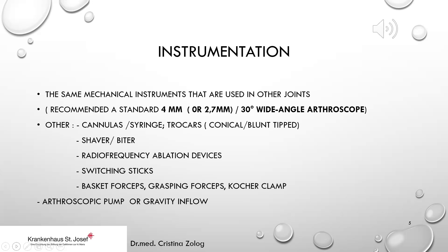Other instruments needed include cannulas, syringe, trocars — which can be conical or blunt-tipped — sheath, shaver or biter, radiofrequency ablation devices, switching sticks, basket forceps, grasping forceps, Kocher clamps, and of course an arthroscopic pump or gravity inflow.